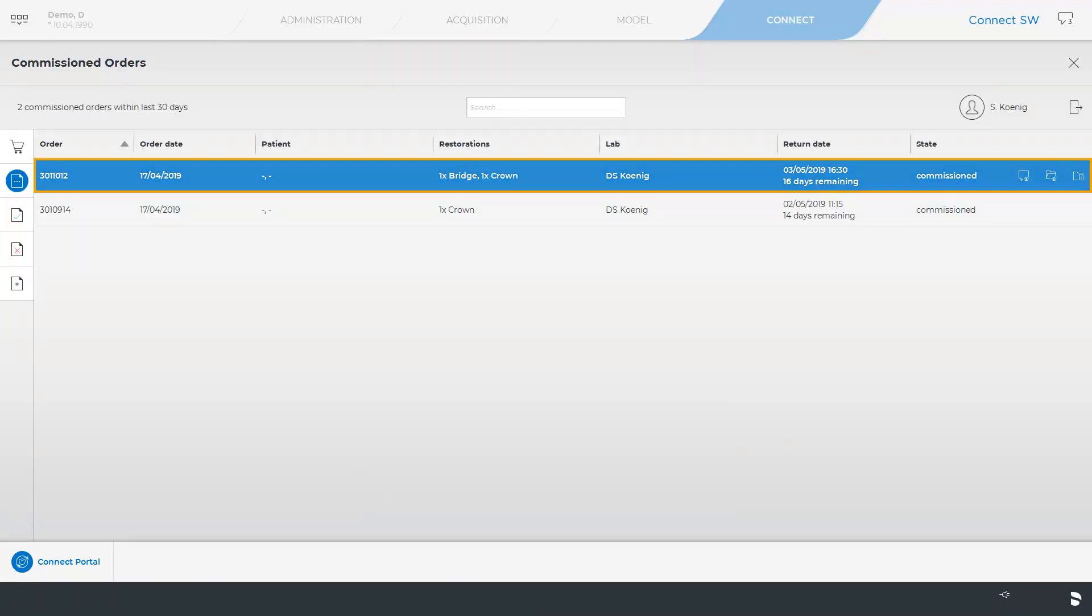Now we have ensured that the patient case is commissioned. Information concerning data reception on the laboratory side can be found in our video tutorial on the topic of Data Reception and Further Processing with Connect Case Center Inbox.